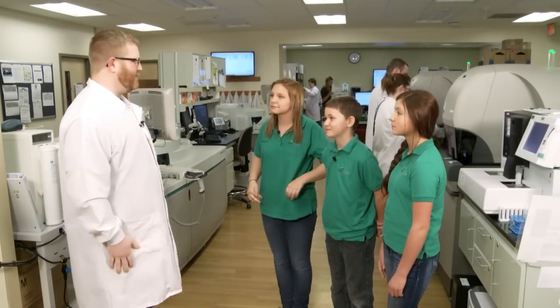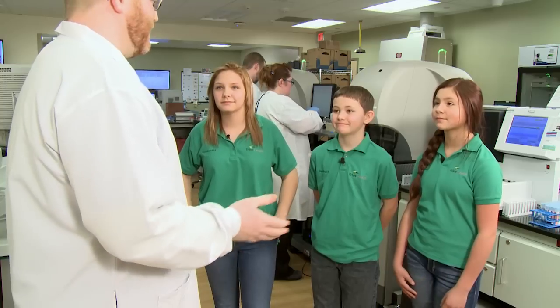Welcome to the lab at TRIOS Southridge Hospital. This is where we process all of the blood and other samples that we collect from patients. We do all sorts of different testing so that the doctors can help figure out what's wrong with you or see if you're perfectly healthy.